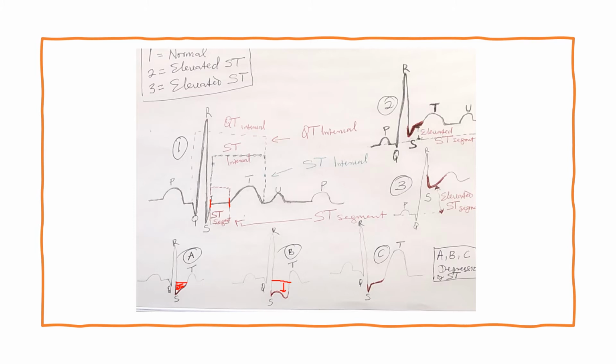And here, same thing is happening, it's down. So this is depression. This is depression. Unlike this that is elevated. See, if you go from here, it is elevated.